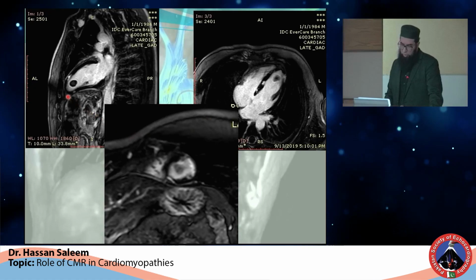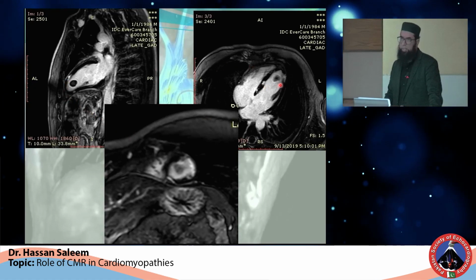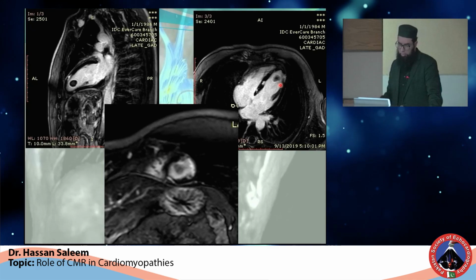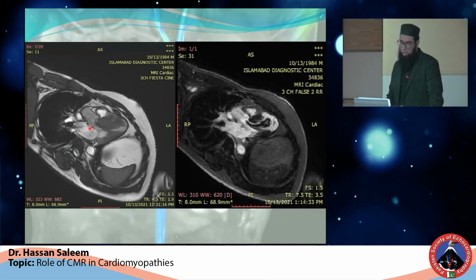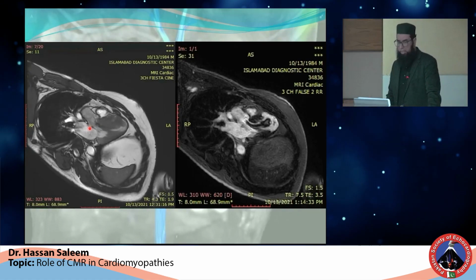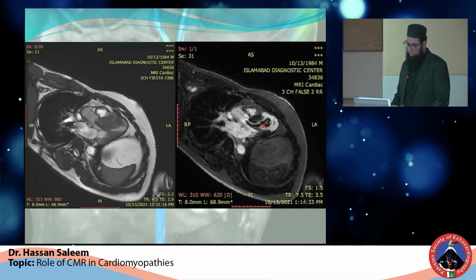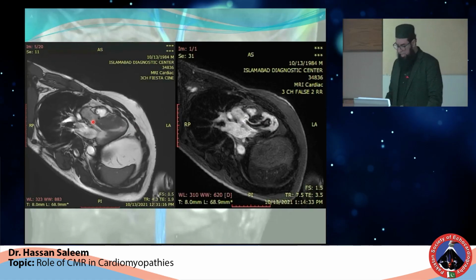Also, you can do LGE, and in the similar patient, you can see some patchy areas of subendocardial LGE there. So the primary diagnosis of the thromboembolic phenomena was made. There's another case here. You can see a large fluttering thrombus there, about to get dislodged into the systemic circulation. And there's a large apical and LAD territory infarct in the apex. You can see non-enhancing thrombus there. And that's the aorta where it is, kind of on the edge.